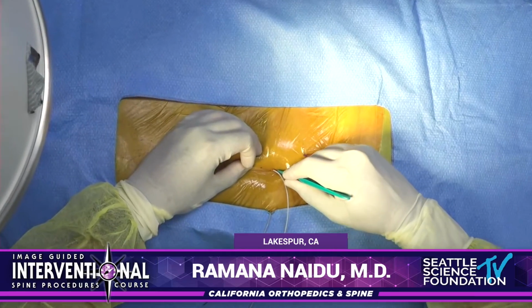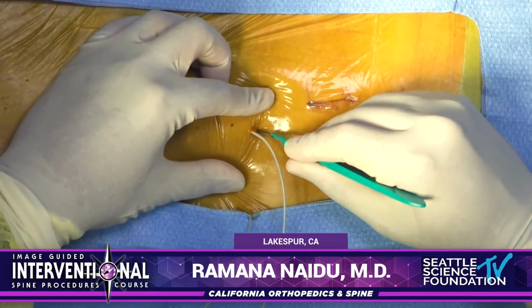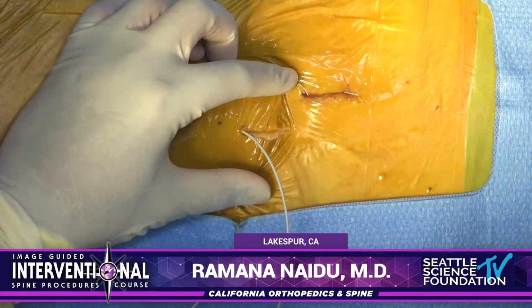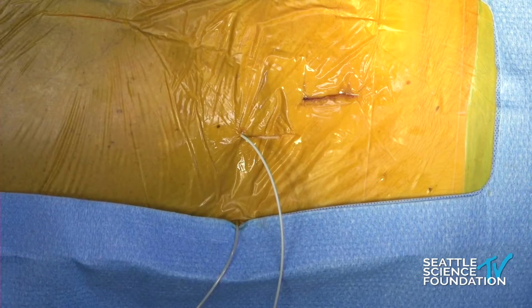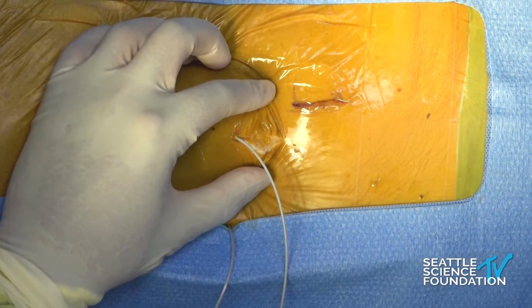Anchoring is the most important part of the entire procedure. With anchoring, we are literally anchoring the system to the patient. And that is really the most important thing so that the leads don't migrate.